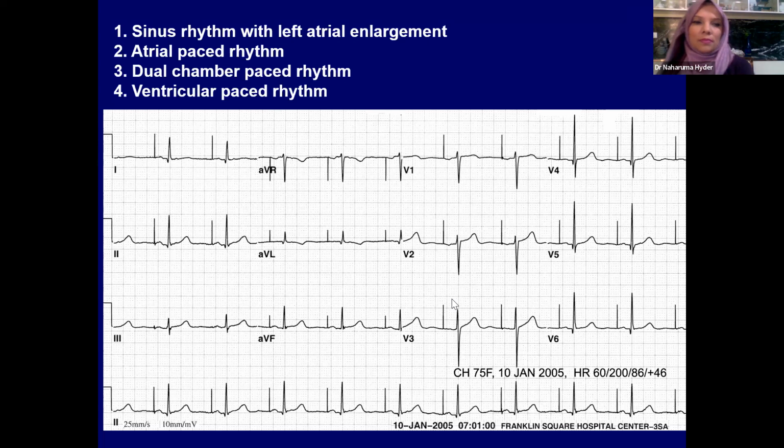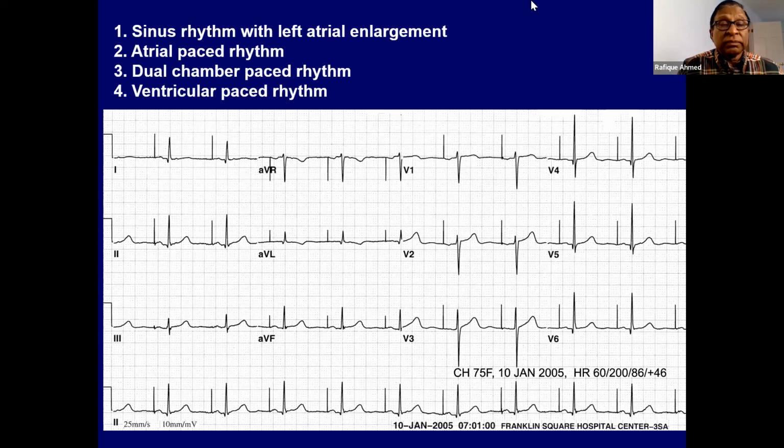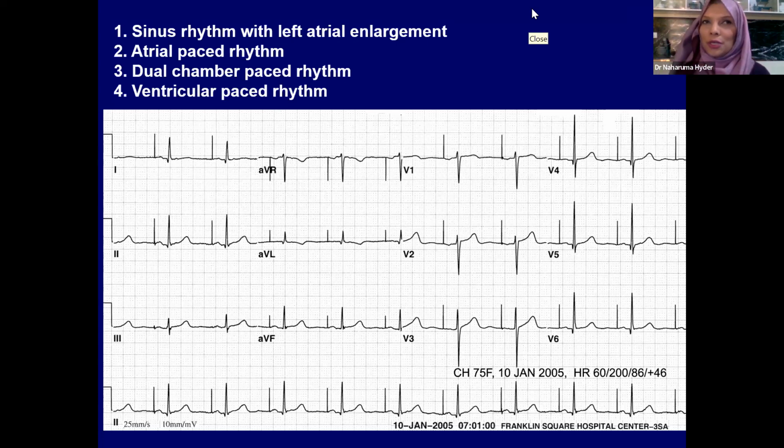Yes, sir, to correlate. And there is another question that Dr. Arif Hussain asked: how frequently should we do ECG in ASD for arrhythmia? Sir, in ASD, every patient should have an ECG during follow-up, because as I told you, hemodynamic changes occur, and the QRS changes that I have shown reflect the magnitude of the shunt. In ASD with a small shunt we usually give 6-month follow-up, and it also depends upon the symptoms. If symptoms develop and it is a significant shunt, then we give short follow-up, like 3 months. Sometimes, if severe pulmonary hypertension comes, we give follow-up in 2 months, 1 month, even after 15 days. It depends upon the severity, symptoms, and age of the patient.